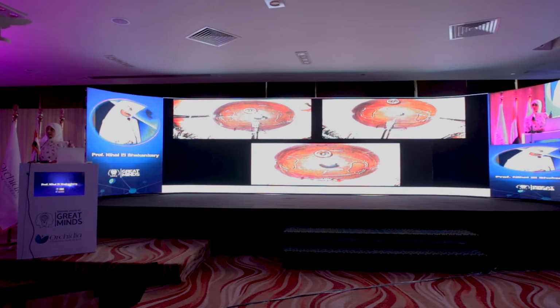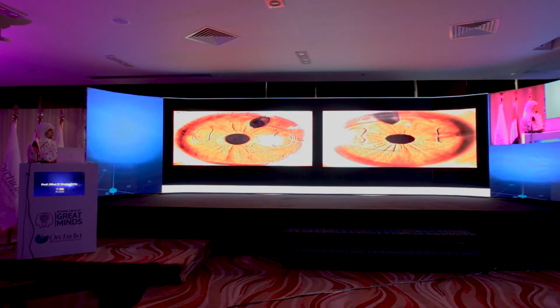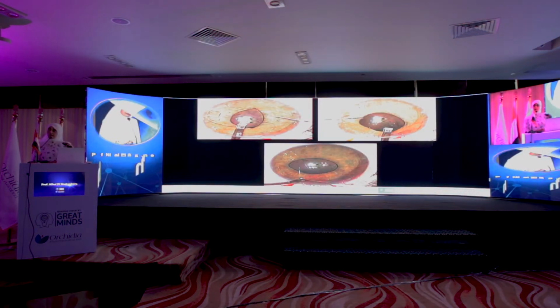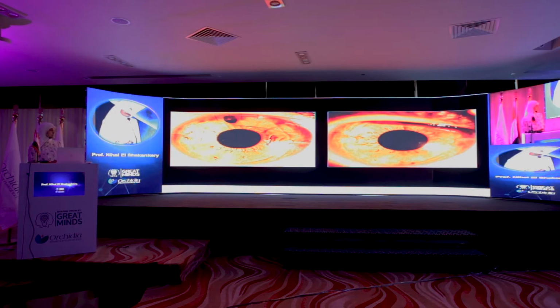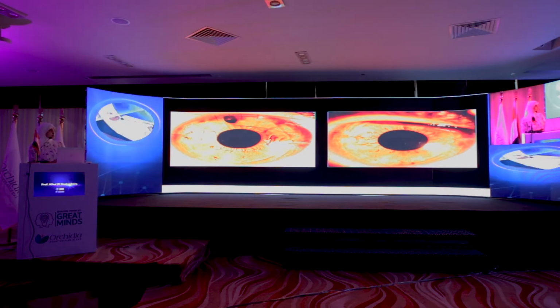In these children, we can implant an iris claw lens as a secondary procedure in the anterior chamber, and here immediately after surgery, few weeks after surgery, and an eye few years after surgery. Or we may implant the iris claw lens into the posterior chamber, and here we can see the enclavation of the iris from the back surface of the iris.